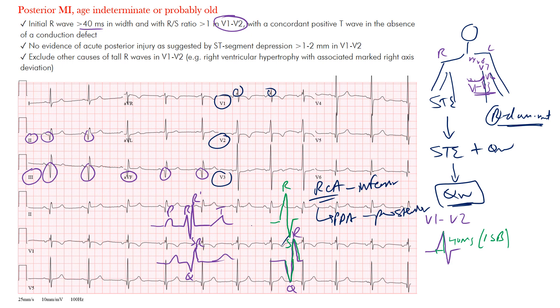Notice in these leads you have big R waves forming, some notching, and a wide R wave in V1 and maybe V2 as well. Regarding concordance — meaning the main QRS vector and the T wave going in the same direction — in this case we have the main QRS vector likely positive but the T wave is negative. In V2, the QRS complexes are mostly positive but the T wave is negative, which is discordant.